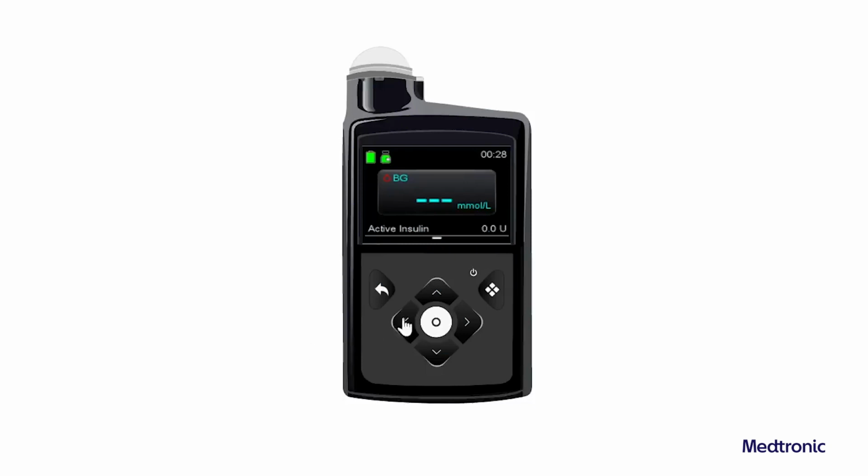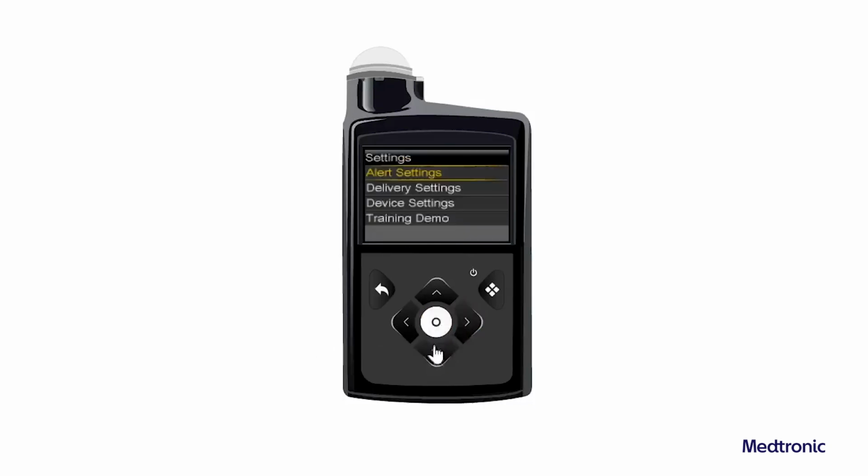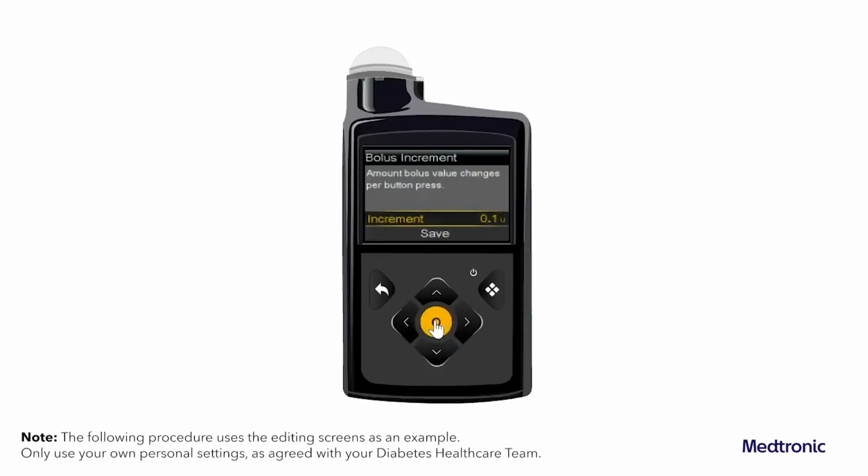To set the bolus increment, from the home screen, press Select, and then select Settings. Select Delivery Settings, and then select Bolus Increment. Select Increment to set the desired increment value. Select Save.